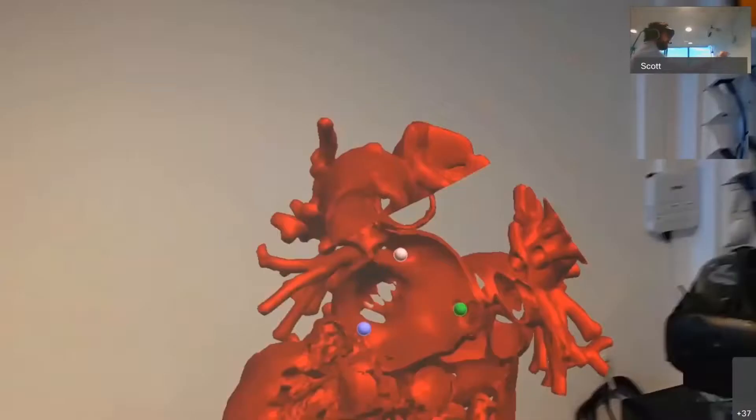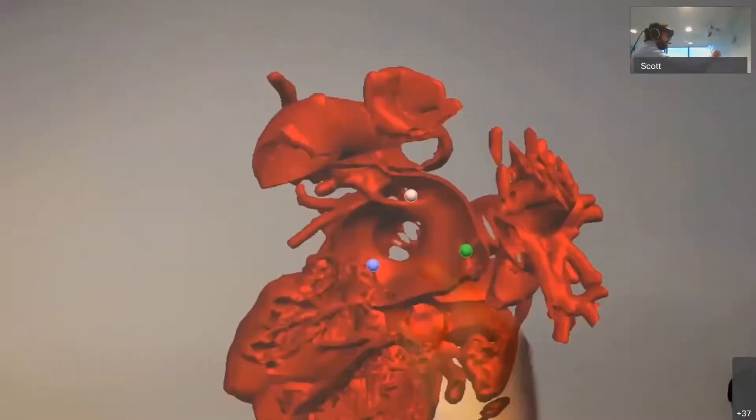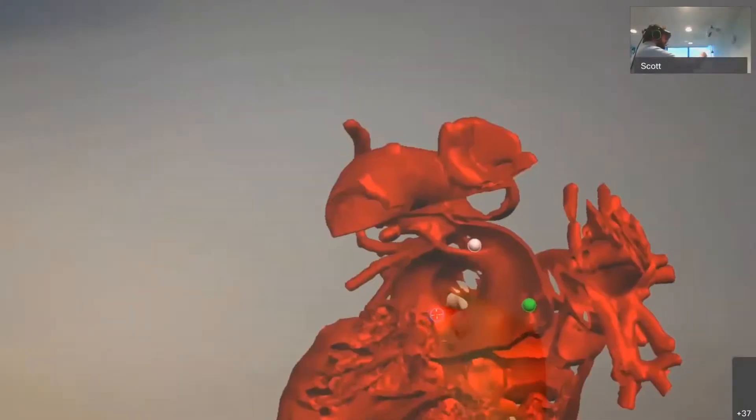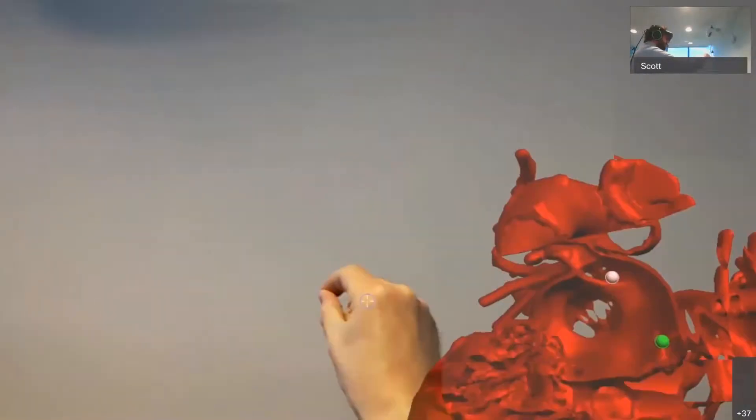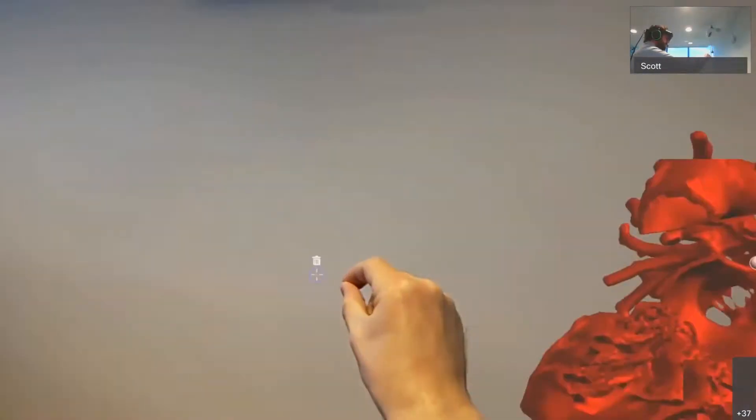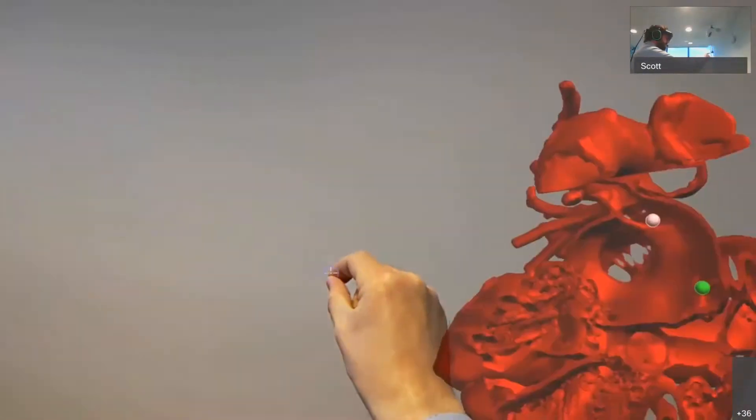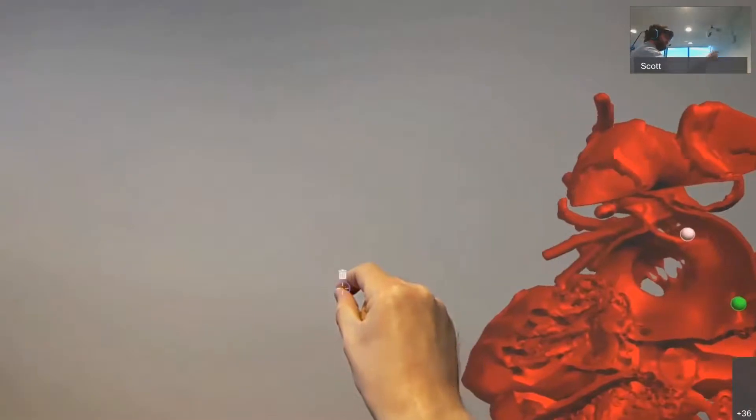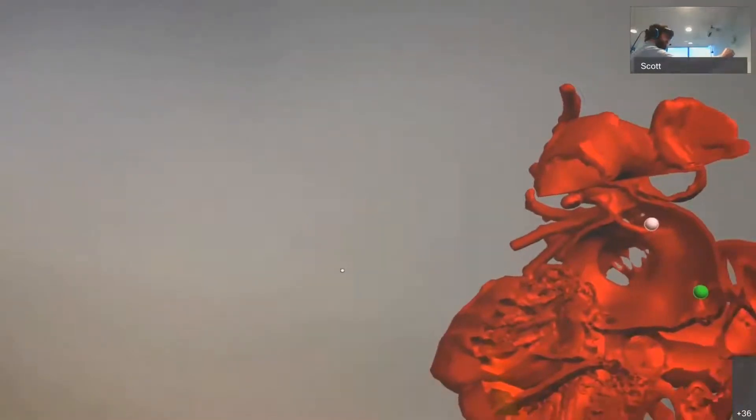And if I want to remove those markers, I can just grab them, move them away from the heart, and a trash icon appears. I can let them go.